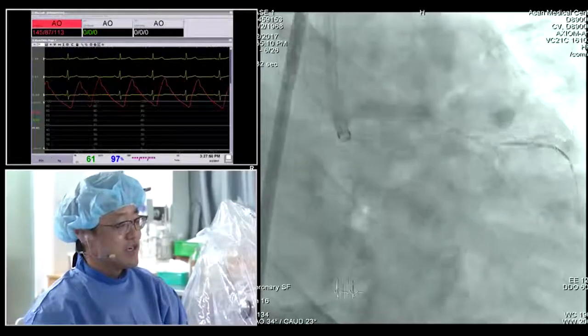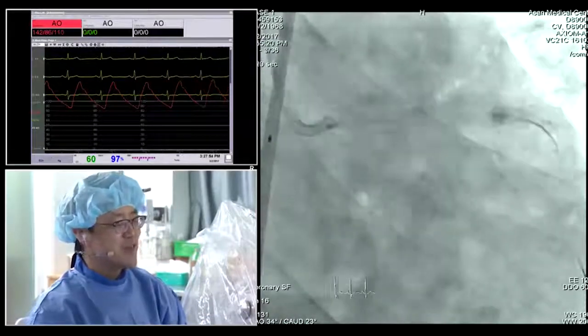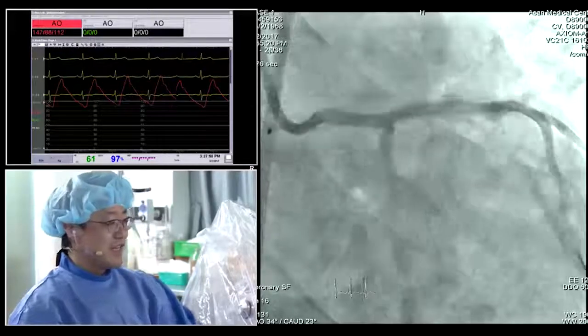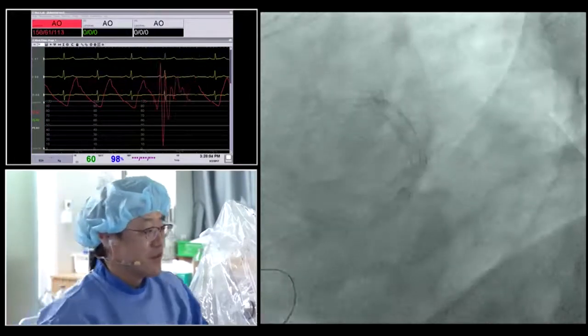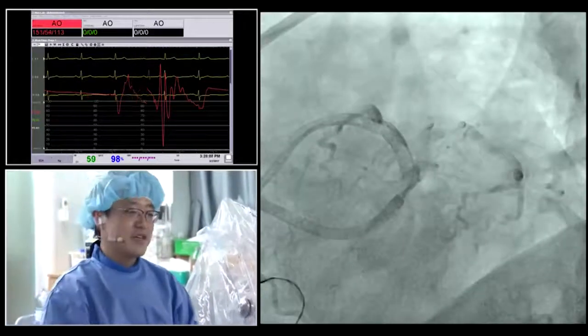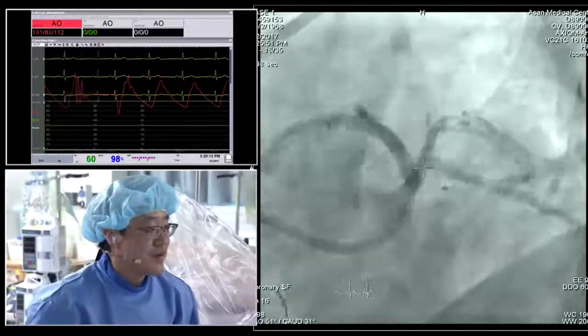And then next we checked the coronary angio. It's okay. Yeah, that was the procedure we did at this time. And then spider view? Yes, spider view. One more view here? Yeah, okay. Angio ready? Shoot. Okay. Very nice. Great. All right. That is the final.